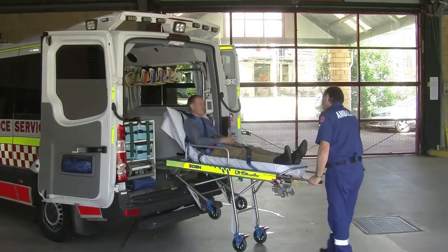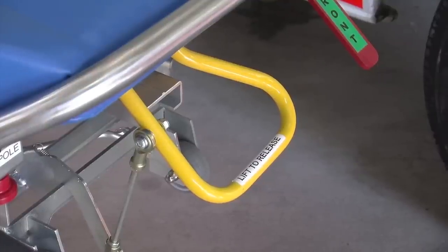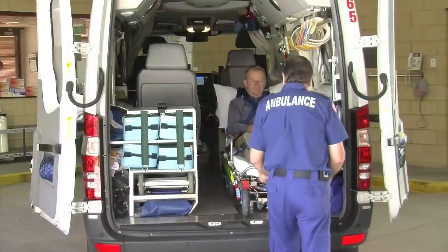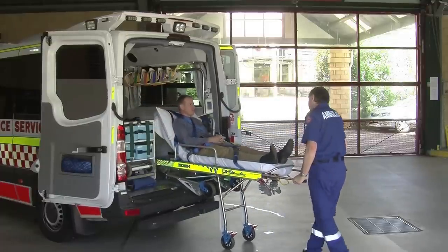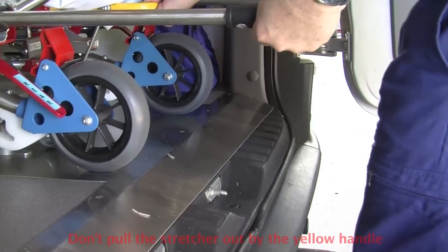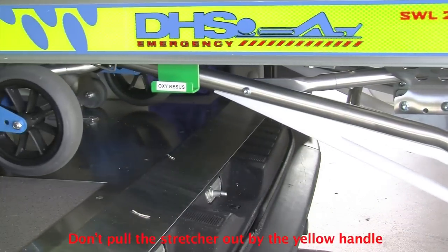For added support, continue to pull the stretcher out using the extension handles. Under no circumstances should you pull the stretcher out by the yellow release handle. As you remove the stretcher from the vehicle, you will hear four distinct clicks as the rear legs drop into position. Each of these acts as a brake to prevent collapse, but they will not engage if the stretcher has been pulled out using the yellow release handle.